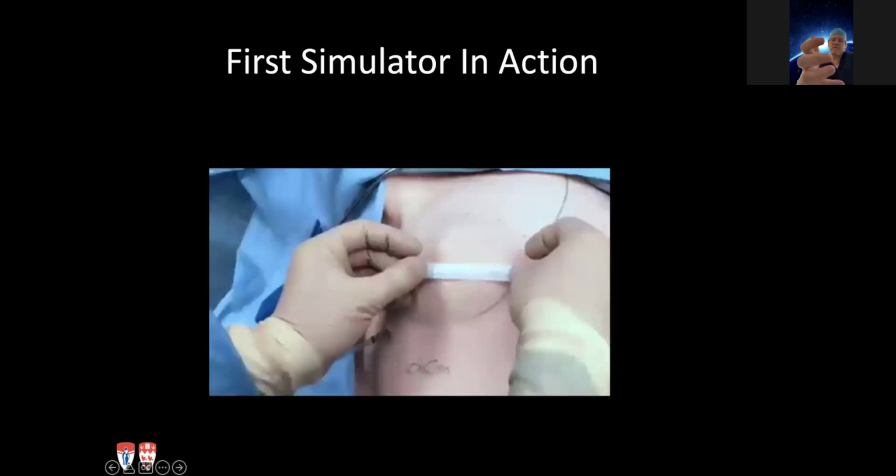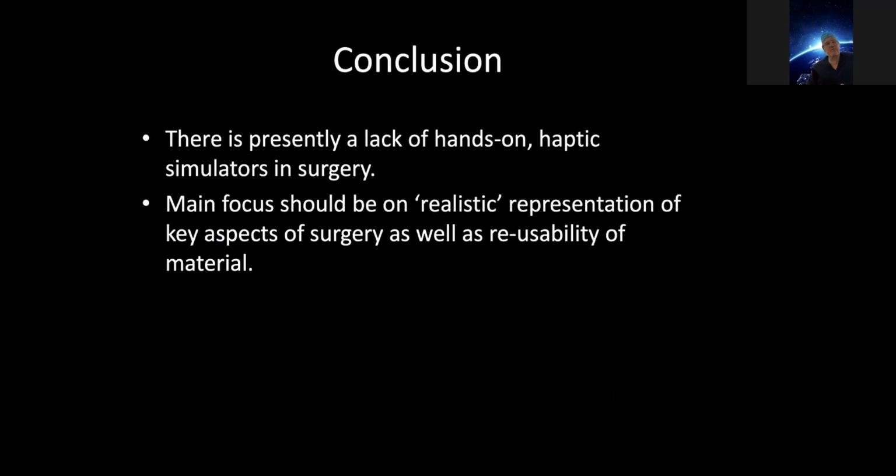And that's exactly what we would try to achieve in the bariatric simulator, which we're about to develop and test with Sean. Now, to conclude, this is more like a personal view of simulation in surgery. I definitely feel that there is a lack of hands-on haptic simulators in surgery, and that the main focus should be on realistic representation of key aspects of surgery. And as well, and that was actually the most difficult thing for us, reusability of material.